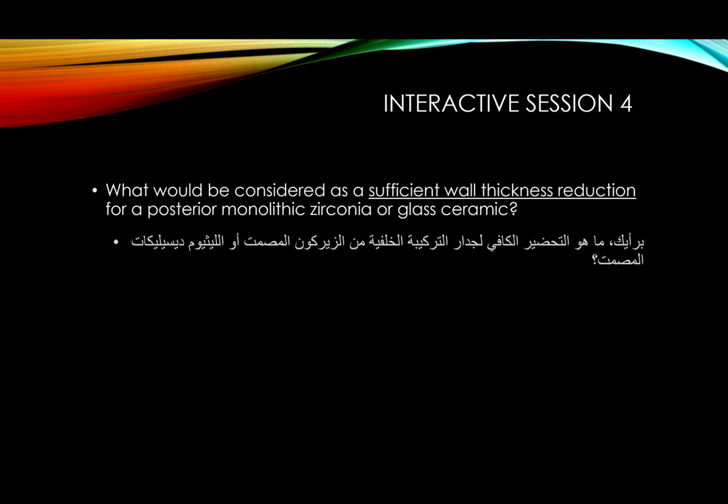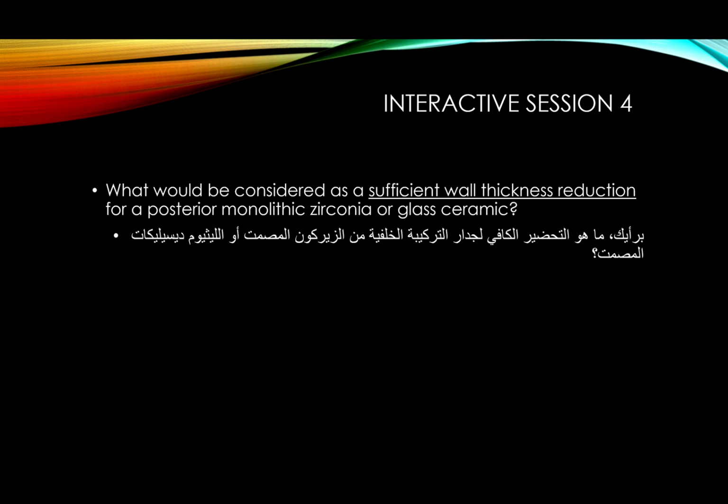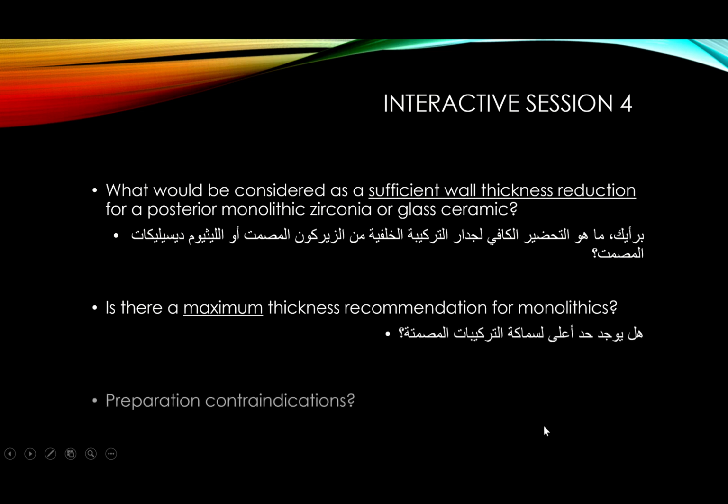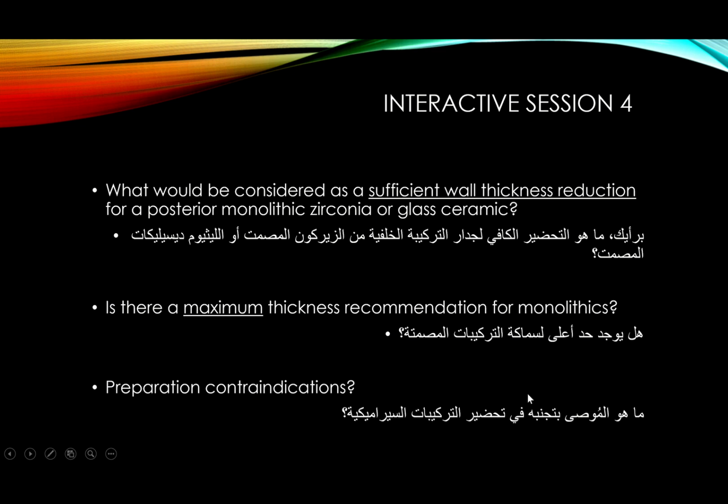Now we discussed what would be considered a sufficient wall thickness reduction for a posterior monolithic zirconia or glass ceramics. We said 1 millimeter at least if you want to be safe. All right, the less reduction you give, the more chance you take. Is there a maximum thickness recommendation for a monolithic? Nothing that I know of. No, there isn't a maximum thickness recommendation. Preparation contraindications, we talked about this.